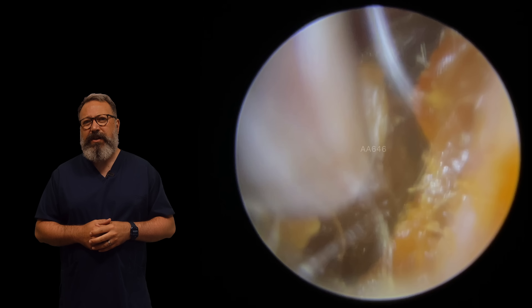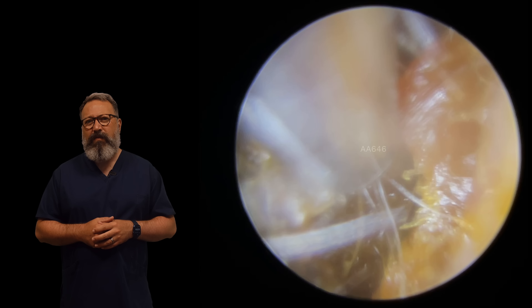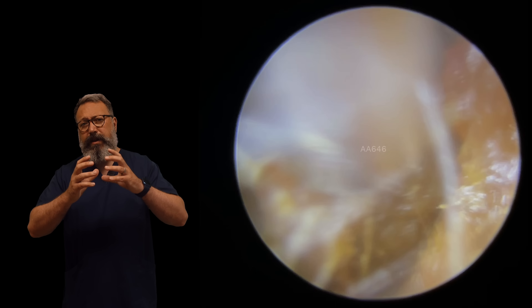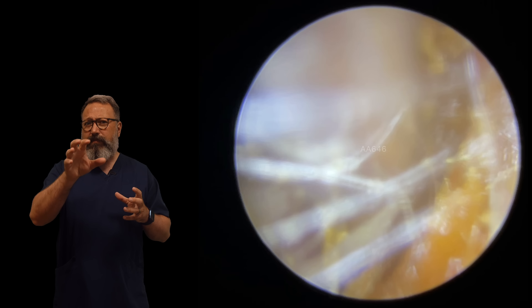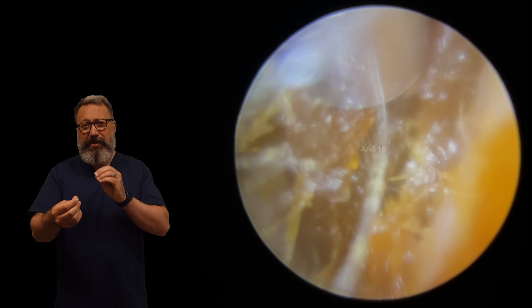We've got a good grip on the outside edge here. You can see I'm just wiggling this around, just trying to clear this. We've basically got this central plug in here that's not really wanting to come out very easily. Now usually the reason for that is it's a little bit longer or there might be a little bit of dry skin mixed in with it.